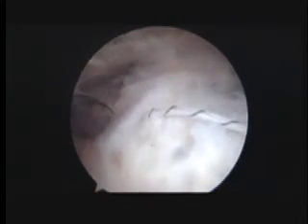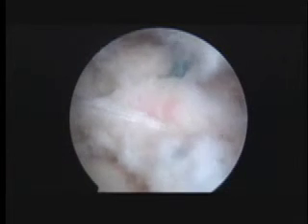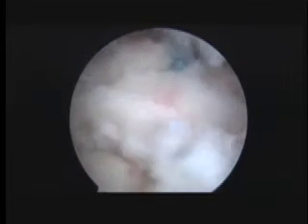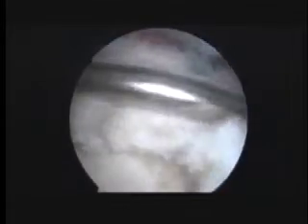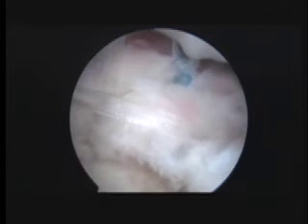Okay, let's get that. Okay, so we'll keep tying knots just like that. We'll show you some more in a little bit. On the screen is the biceps tenodesis part of the surgery. We've already passed and tied all 6 sutures from the 2 anchors that we placed. So you've ended up with 2 metal suture anchors and a total of 6 sutures to anchor that rotator cuff back down to the bone.